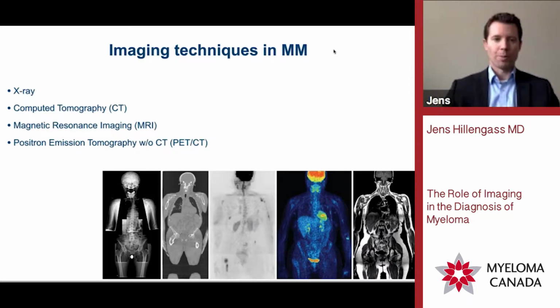Magnetic resonance imaging is based on the water content, and as you know, a really high percentage of our body consists of water. This distribution, where there is more water or more fat, is what matters for MRI. Water and fat distribution are the information that provide the MRI image.